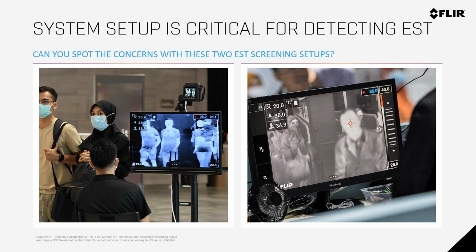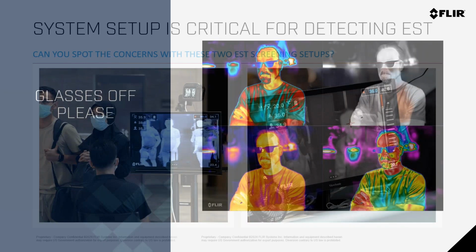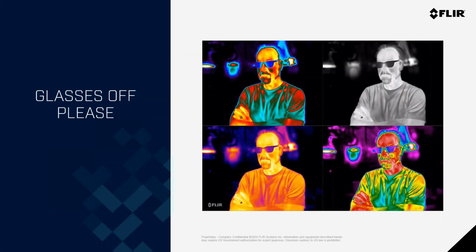So cameras, thermal imaging cameras, visual cameras, they can't focus on two different things at two different distances. And so if you ever have a system set up like that, somebody is going to be getting read incorrectly because the camera cannot decipher both of them at the same time. So one of the most important things is that you take your glasses off, and this is just kind of a fun slide of some different pictures, different color palettes here of this gentleman, and you can see the reflection, or at least that the eyeglasses here are a lot cooler than the rest of his body or his face or his surroundings. So again, thermal imaging cameras cannot see through eyeglasses. It's very important that we take those glasses off because the inner canthus of the eye is going to be your best correlation to body temperature, and that's the temperature measurement we want to get.